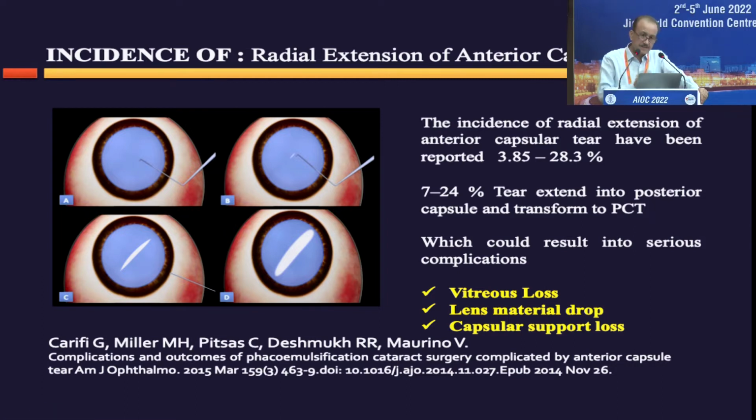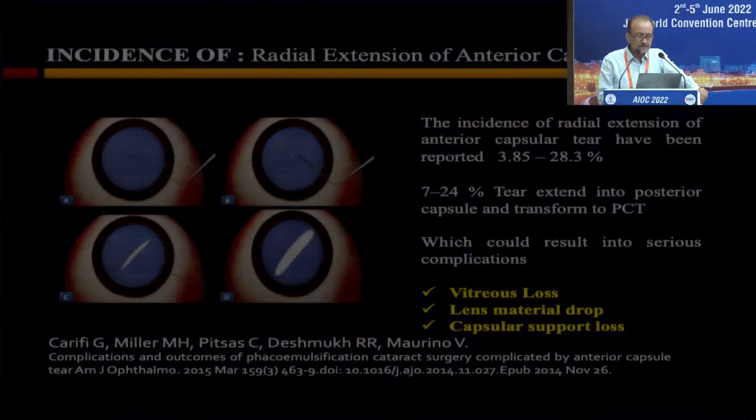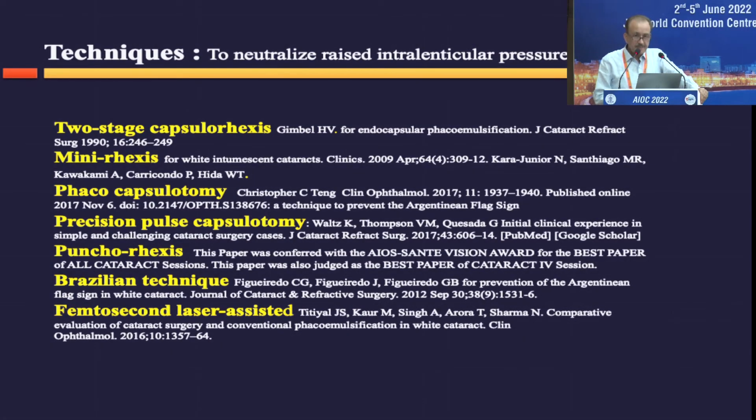If the tear extends into the posterior capsule, then we may land up with many complications like vitreous loss, lens material drop, and capsular support loss. So all these complications come up later on. Several techniques have been described, because this is such a complex situation, and we have to deal with these intumescent cataracts every day, and we land up with this kind of complications.